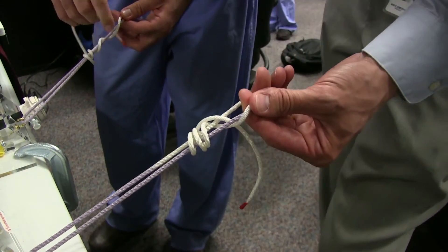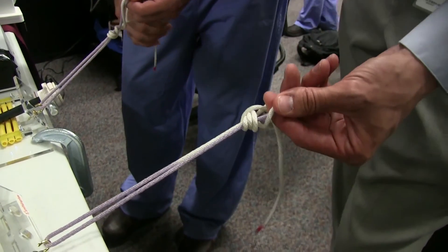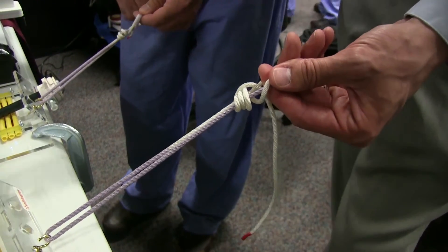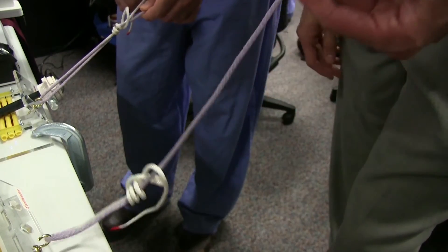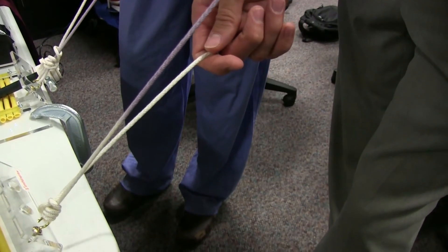Right through here? Yep. Pull it down a little bit, cinch it up just a little bit. And now you can drop the other hand. This hand? Actually don't drop it, but you can just roll loose and just pull with the post.